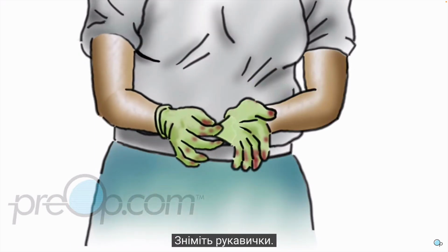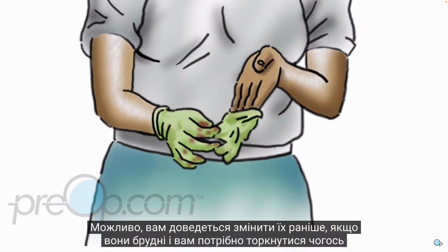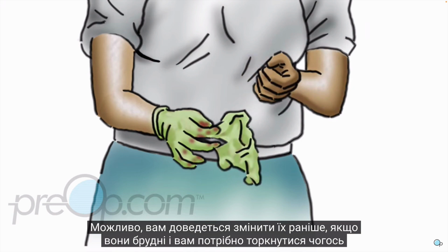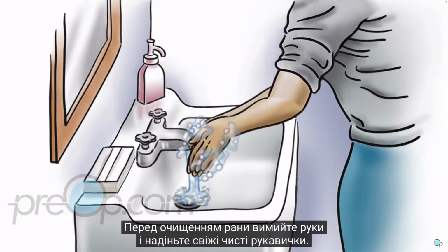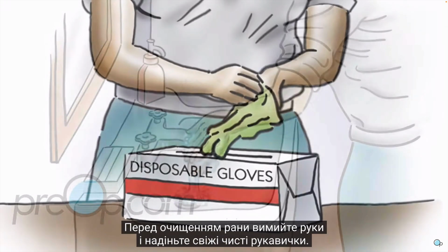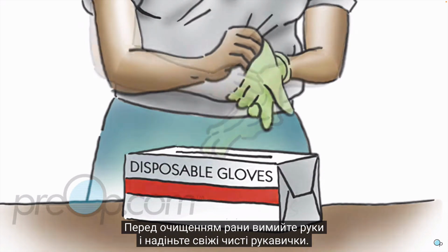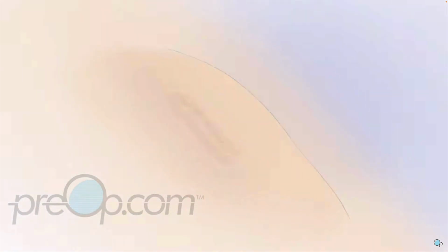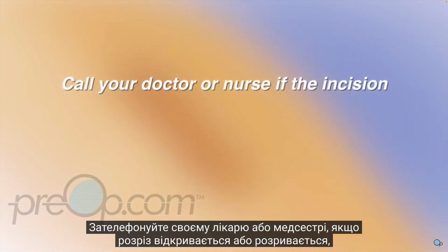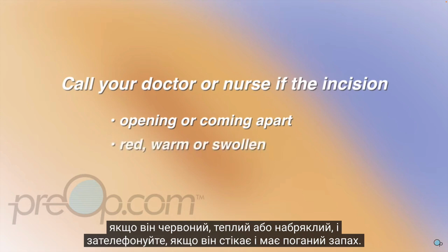Remove your gloves. You may need to change them sooner if they are dirty and you need to touch something clean, or if there is a tear or hole in your glove. Before cleaning the wound, wash your hands and put on fresh, clean gloves. Look carefully at the wound. Call your doctor or nurse if the incision is opening or coming apart, if it is red, warm, or swollen, and call if it is draining and has a bad odor.